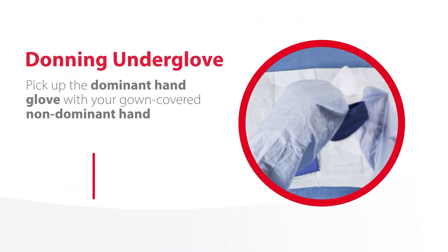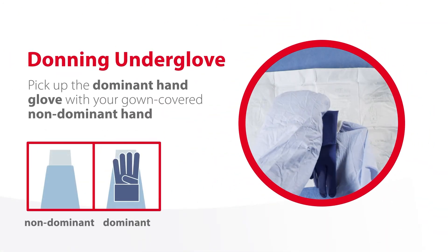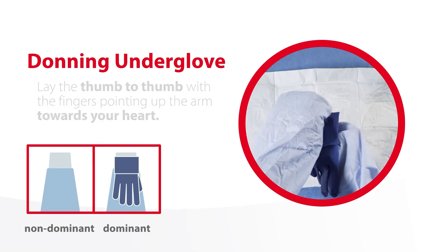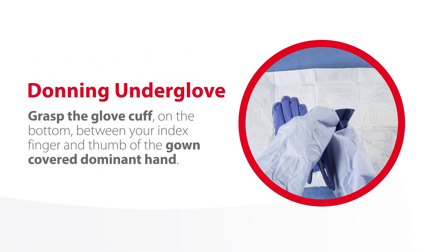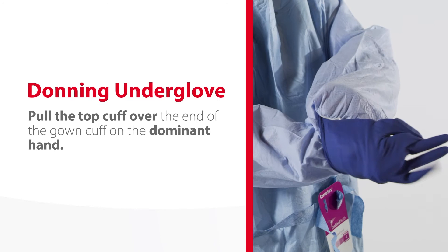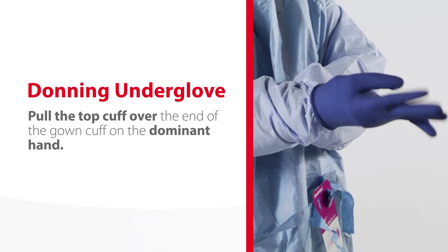Pick up the dominant hand glove with your gown-covered, non-dominant hand. Lay it thumb-to-thumb with the fingers pointing up the arm towards your heart. Grasp the glove cuff on the bottom between your index finger and thumb of the gown-covered, non-dominant hand. Then grasp the glove cuff on the top between your index finger and thumb of the gown-covered, non-dominant hand. Pull the top cuff over the end of the gown cuff on the dominant hand.